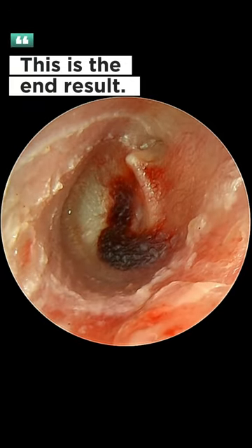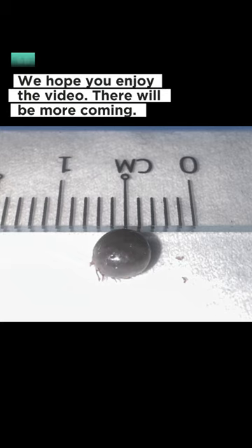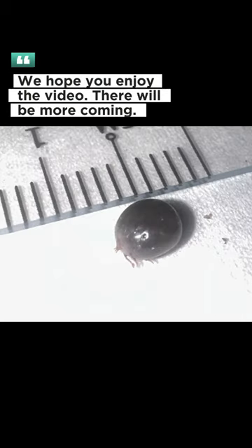This is the end result. Look how fat the tick was. We hope you enjoy the video — there will be more coming.